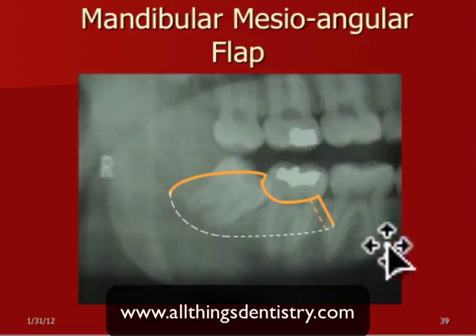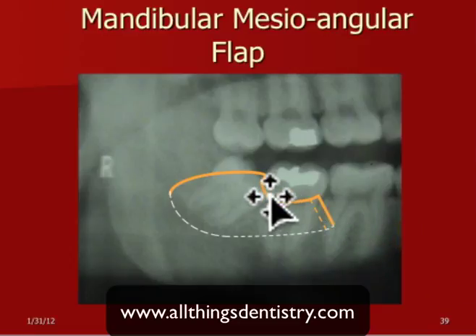This is a case where I use the anterior releasing incision. The tip of the crown is almost a Pell Gregory 3, so anytime it's a Pell Gregory 3, I tend to use this access rather than taking an envelope flap all the way up to the bicuspid. Again, you'll see the base of the flap is wider than the apex. It's undercut here, so this little bevel area right in there. It doesn't have to be a perfect butt joint. You can kind of slide around to make a good juncture and primary coverage.